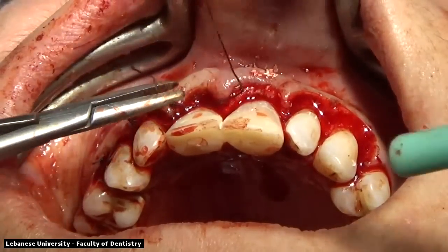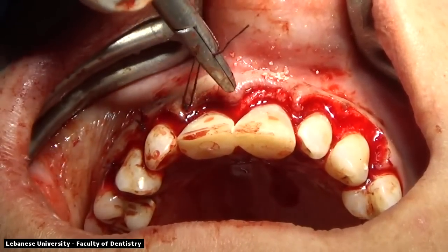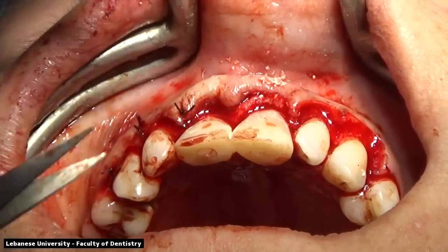As you see, we're doing our best to adjust the flap so that there is no tension at all to the flap itself. The tension will lead to failure of the procedure.